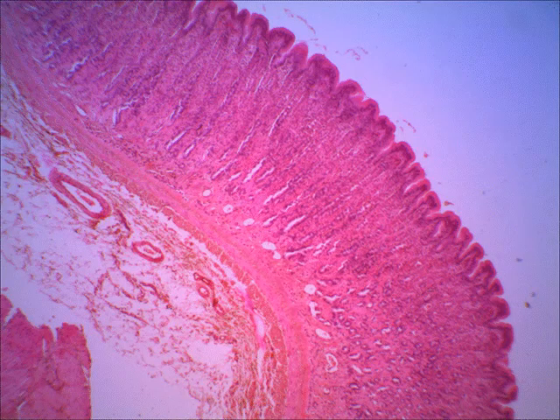I will erase this and try to draw a line within the gland. So that would be a gastric gland. There would be one. You don't see them on a perfect section here, but it's all through the mucosa. You've got a drawing in your lab manual that shows this very well. Now, if we move to another slide.